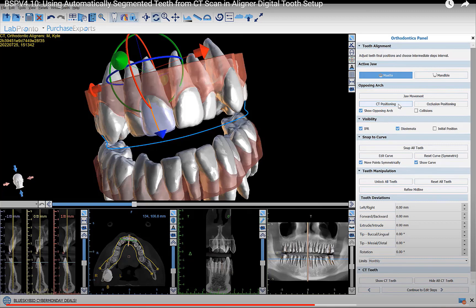The software automatically segments the teeth from the CT scan and automatically aligns them to the teeth in the STL models, so you see the full tooth with the root aligned to each tooth from the STL model. It's part of the digital treatment plan, and as you move the teeth you'll see how it affects the root movements as well. The segmentation and alignment are completely automatic.